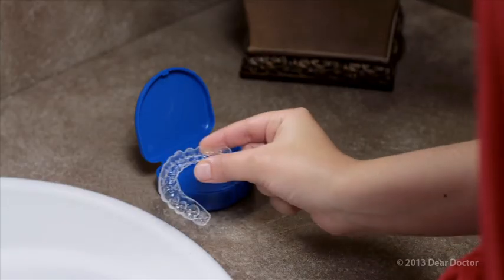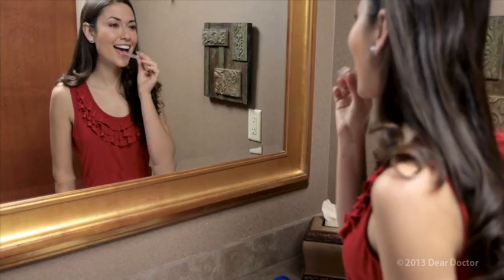Would you love to have straighter teeth but can't see yourself wearing braces? An option to consider is clear orthodontic aligners. Clear aligners are a remarkable way to improve your smile.